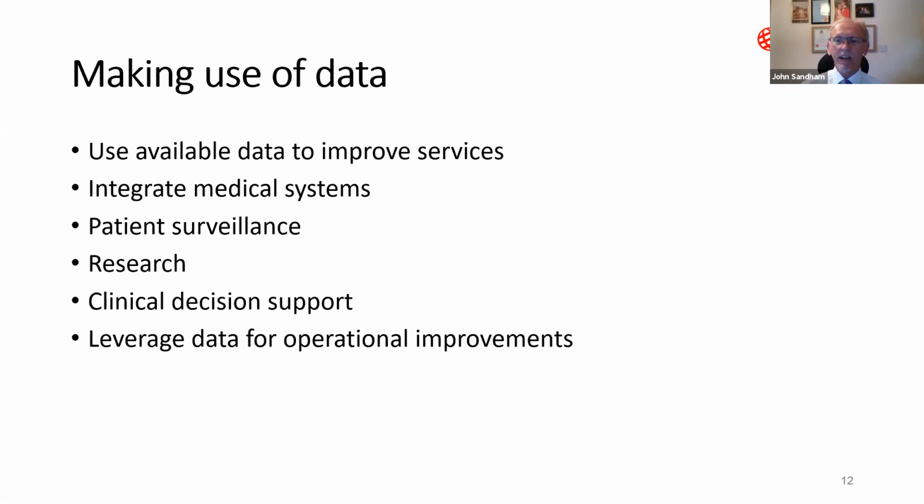We must firstly have accurate data, and the only way to guarantee accuracy is to automate the data transfer. The stakeholders can then use this reliable and accurate data to improve services, carry out better research, and help clinicians to make better decisions. Improving clinical decision support will ultimately improve the efficiency of the organisation, improve patient care, and reduce mortality.